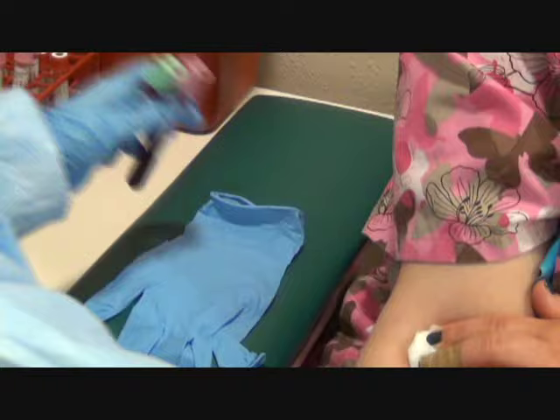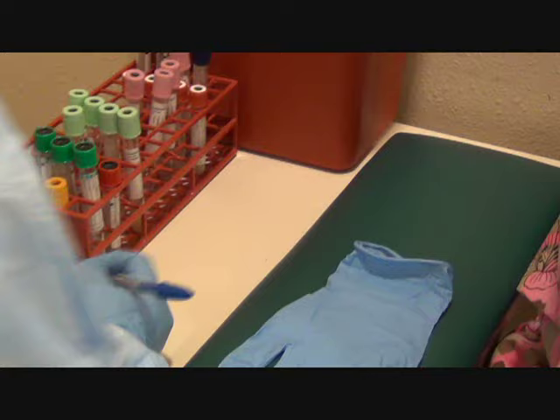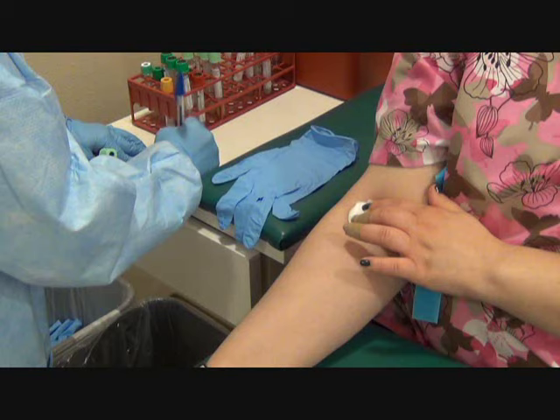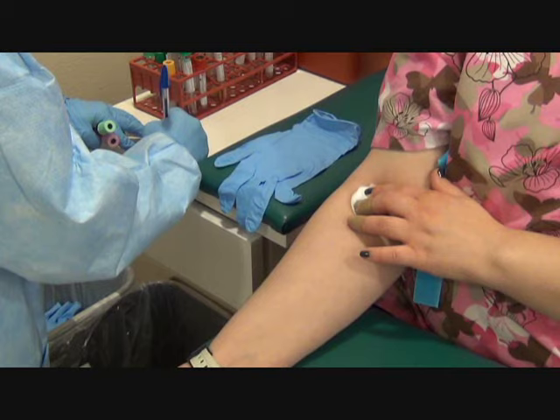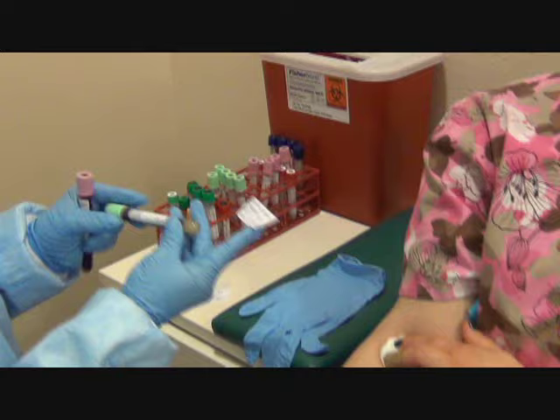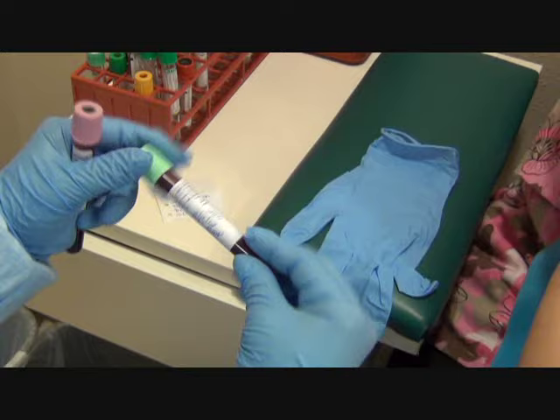Now I'm going to label the tubes. I'm going to add the medical record number, the time, the date, my initials, and the test. Making sure that the label is nice and straight. I leave a window.